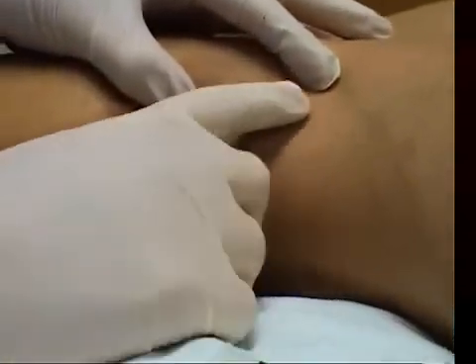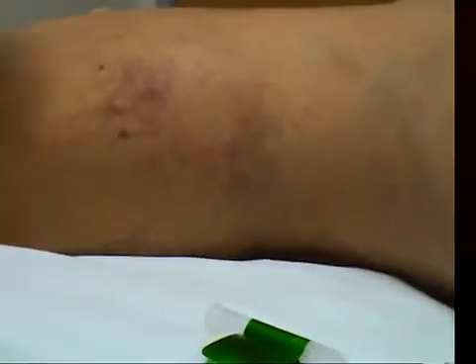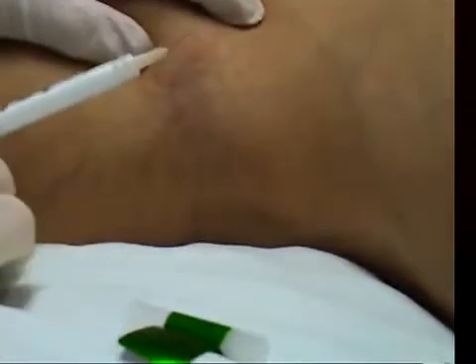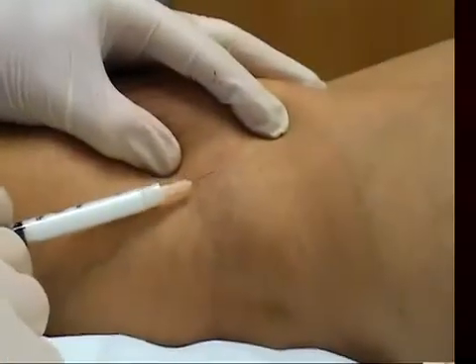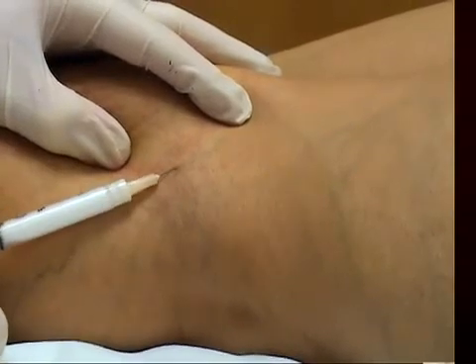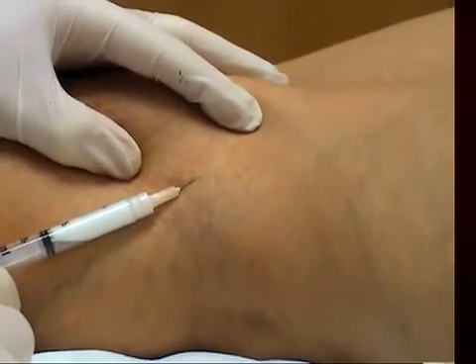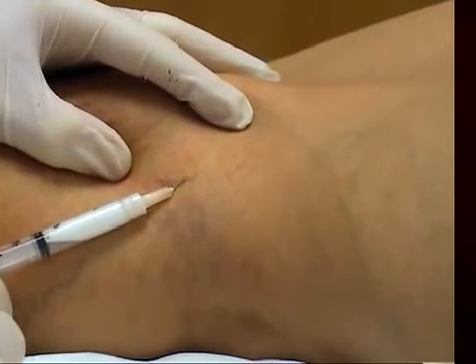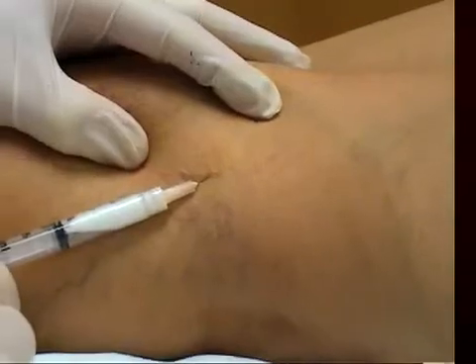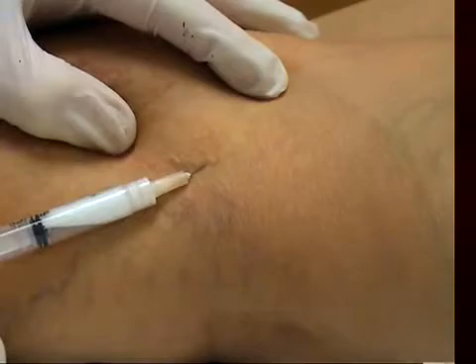We're going to do this area here. You see this is a larger reticular vein underneath here with some lighter pink vessels associated. Many people say that you've got to get the reticular vein first — I don't know how valid that is, but that's what people say, so let's just do it. That's pretty much about as good as it gets in terms of being in the vessel. Don't press too hard on the syringe, otherwise you'll extravasate. You see all those tiny vessels now look white — it looks like a topographical map.